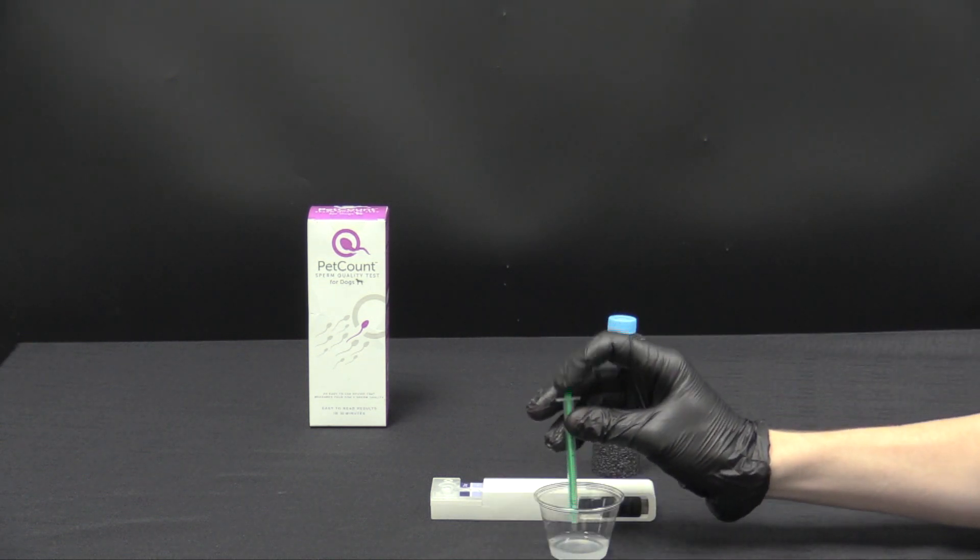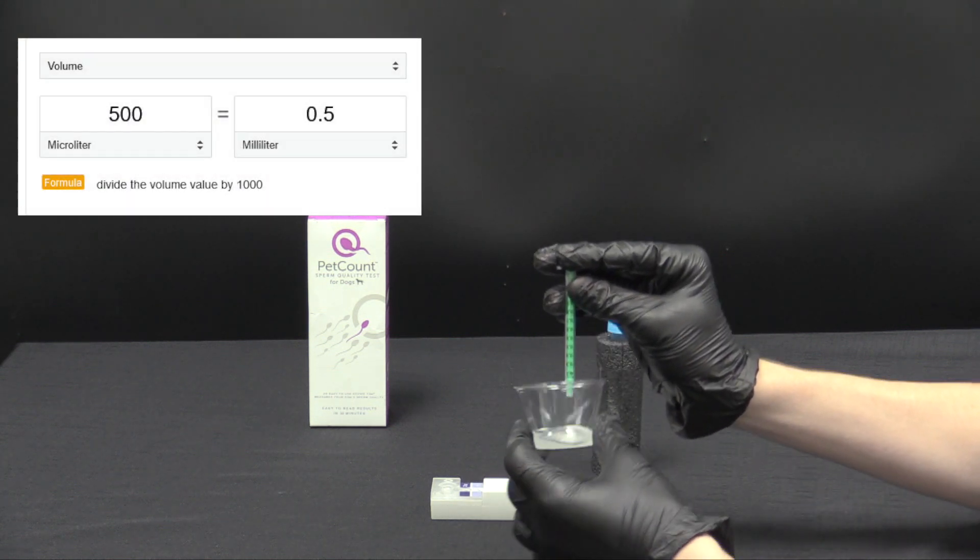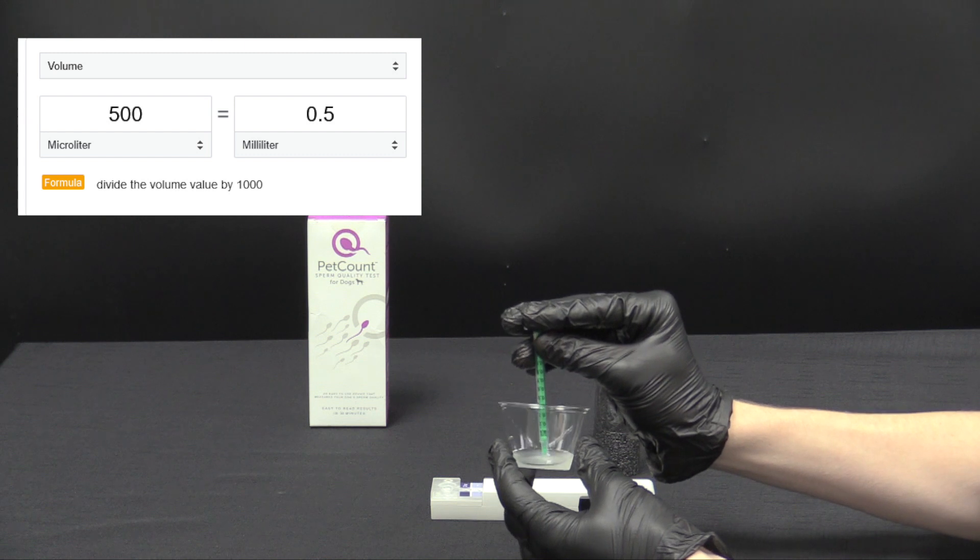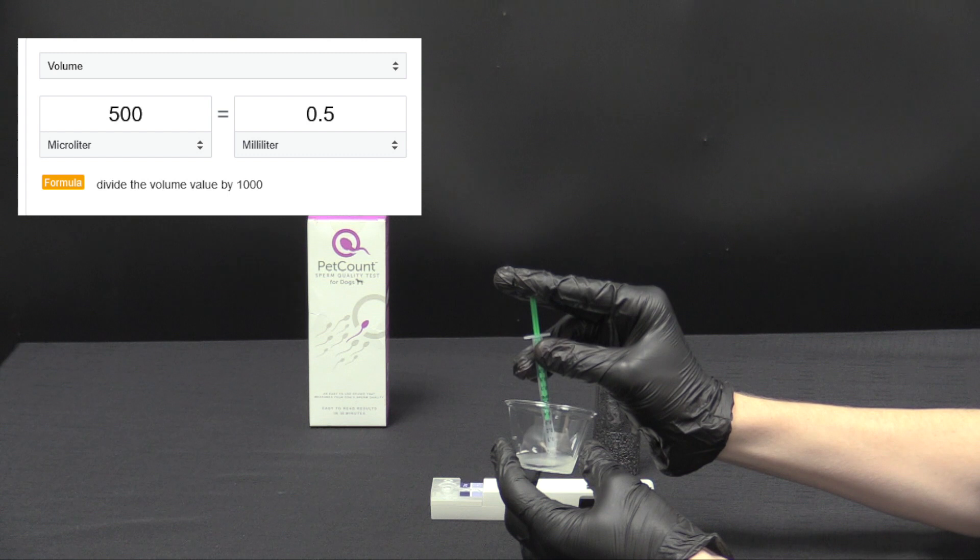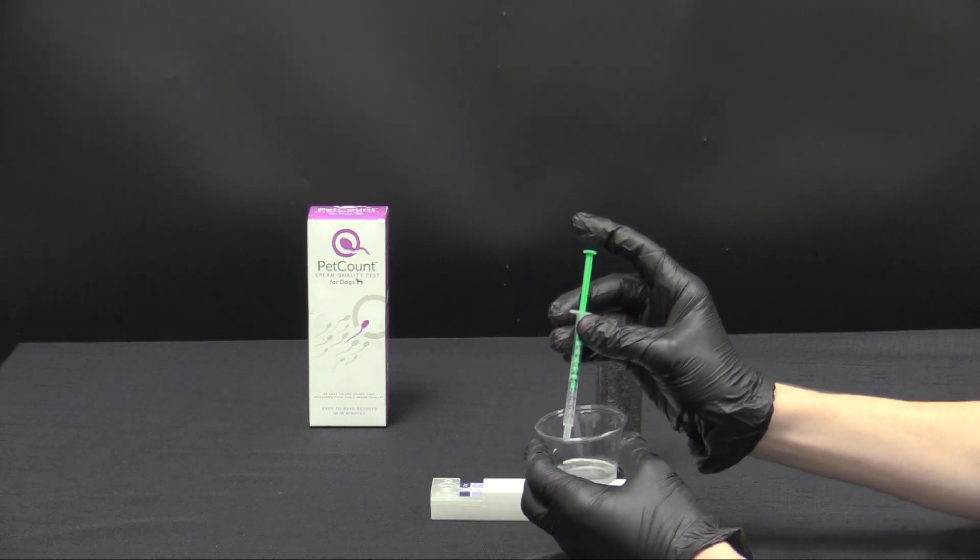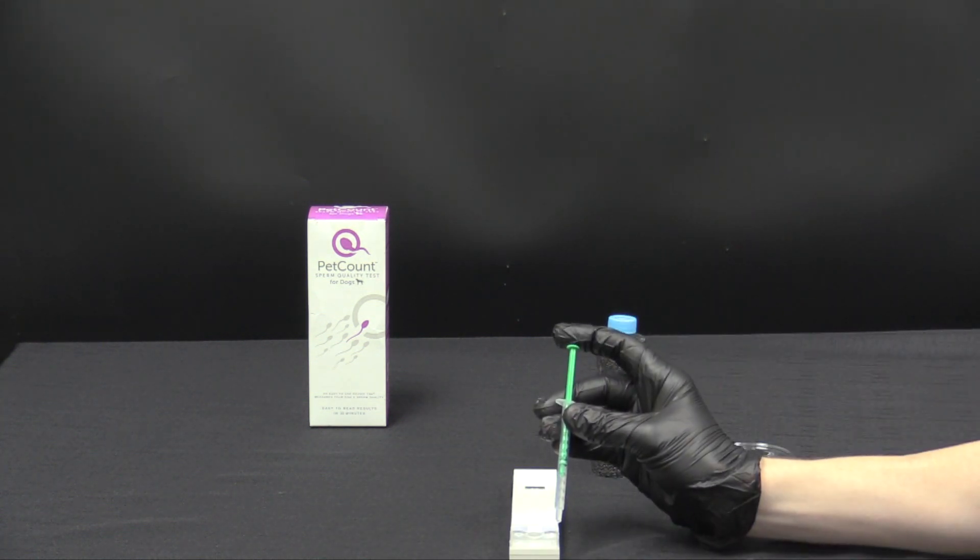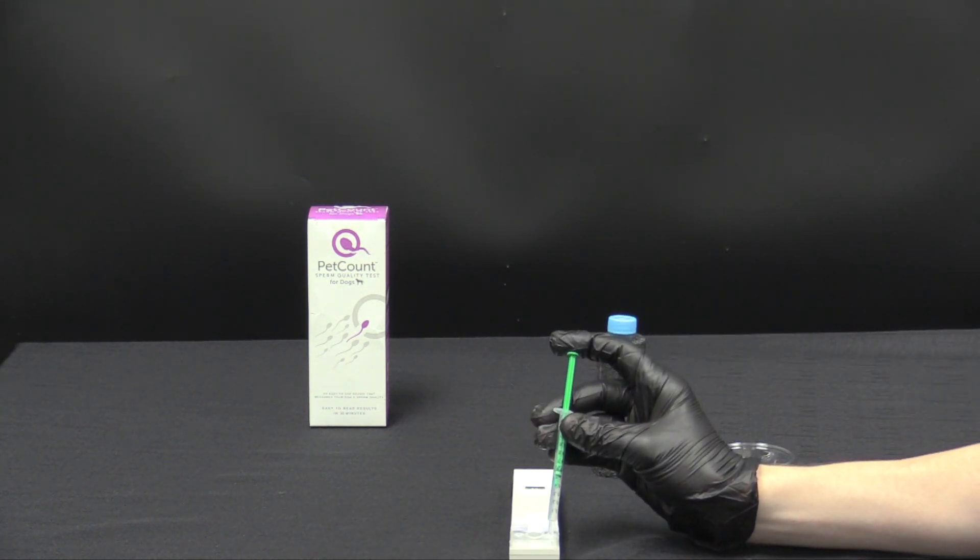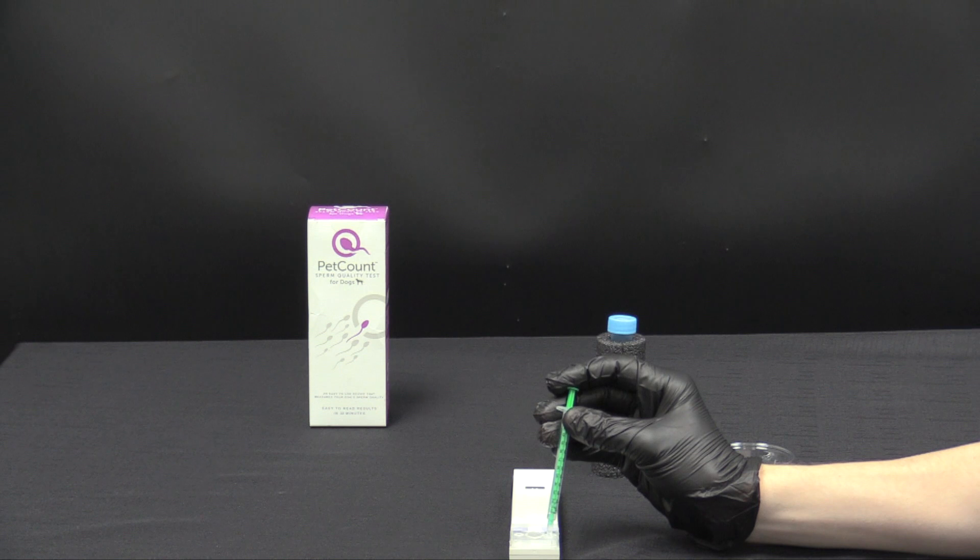All right now we'll pull up the 500 microliters or 0.5 cc's of sperm. Then we'll carefully deposit into the sample well.